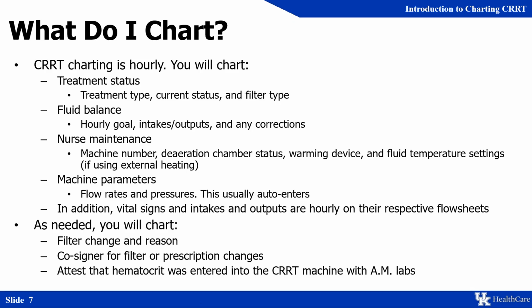Alright, so what are the actual charting expectations for CRRT? This is all coming from policy NE 08-06. Pretty much, CRRT charting is hourly. That's going to include the treatment status, which is the type, current status, whether it's running or not running, and the filter type. It's going to include the fluid balance, and this is really the heart of why you do CRRT charting, which is the goal, intakes and outputs, and any corrections.